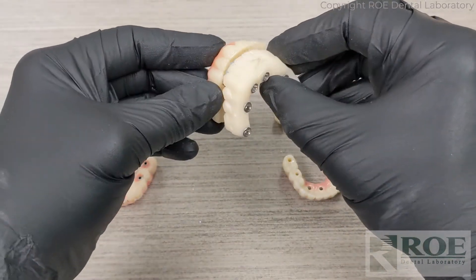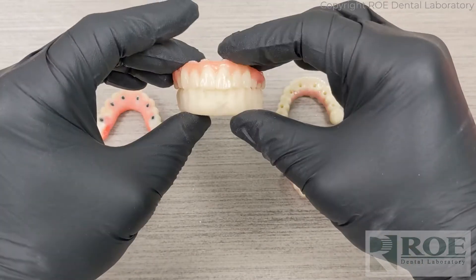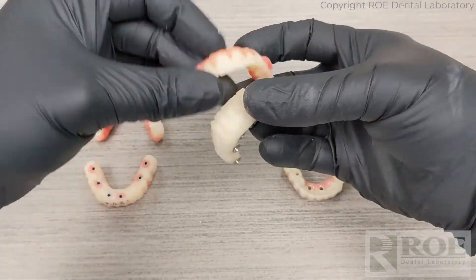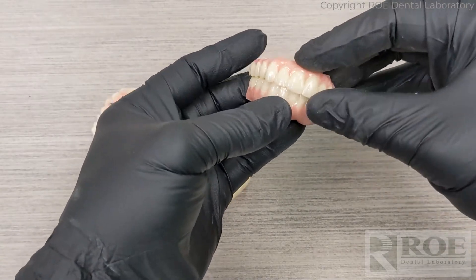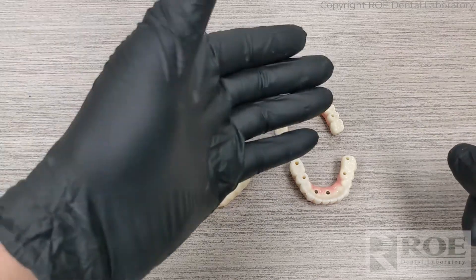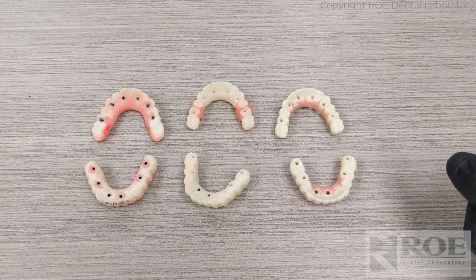So the steps were: sectioned, picked up, bite registration and equilibration, reline impression if necessary — but really it should be ready to go and intimate with the tissue. That returns and then we go to final restoration. This is a nice chrome case that went through the normal process of rapid, try, and final, but just had the little twist of having to section to make sure it's 100% passive.